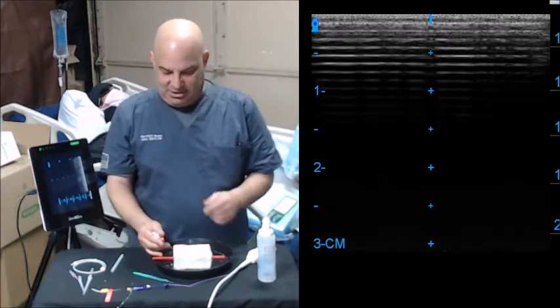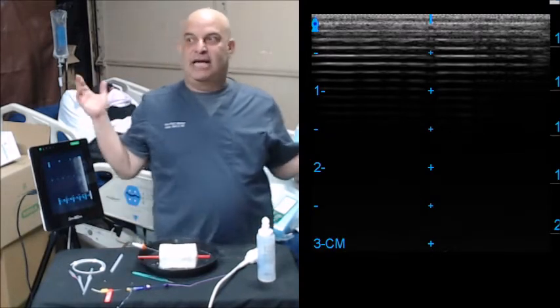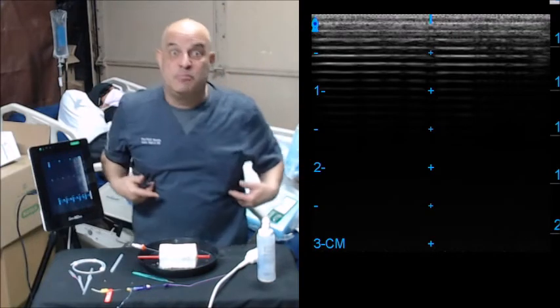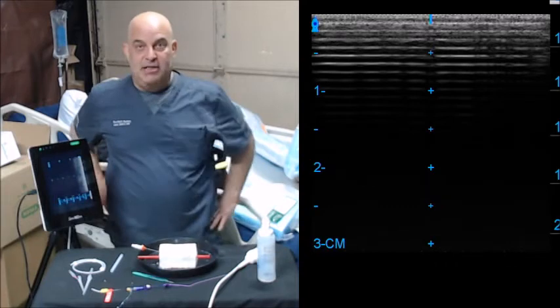If you can find the needle tip and get the introducer onto the vein with the guide wire in the vein like this, that's the job. You're already doing paperwork, you're already doing patient care. That's the job, that's what you get paid for.